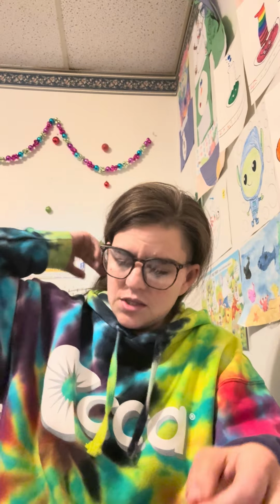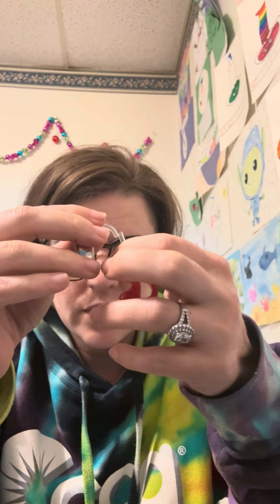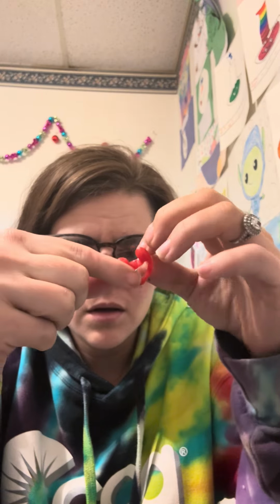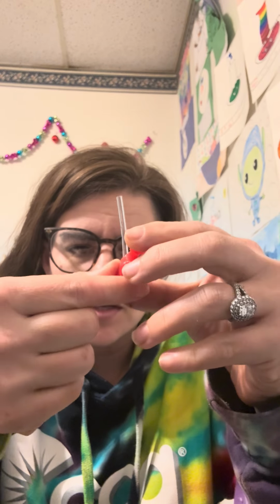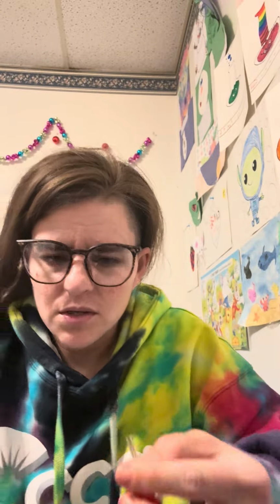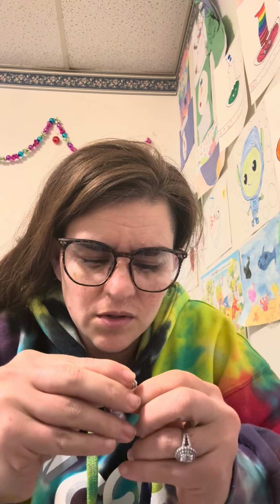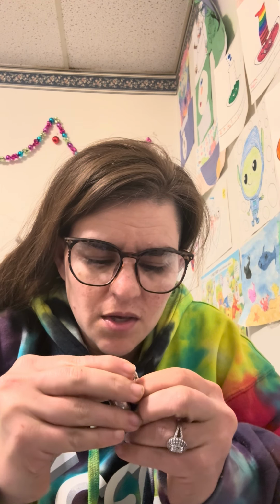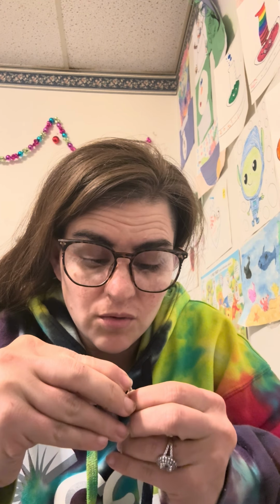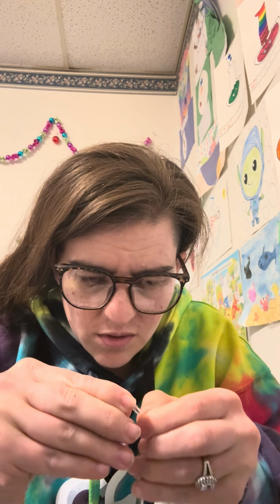Now, you stick this back on your hook. There is a tube expander. If you are having difficulty putting it on the hook, you can go ahead and get a tube expander. But that's up to you. It's personal preference of how difficult it is for you. I've just been doing this a long time that I don't need to have one. But if you need to, you can. And you might need one in the beginning, because you will have a lot of curse words to get it on your hook.